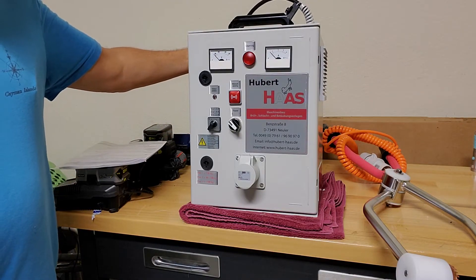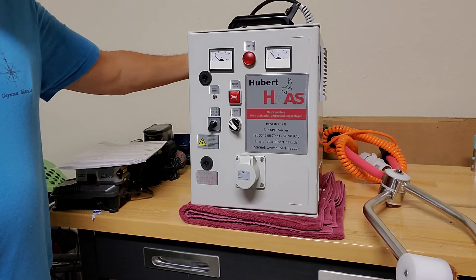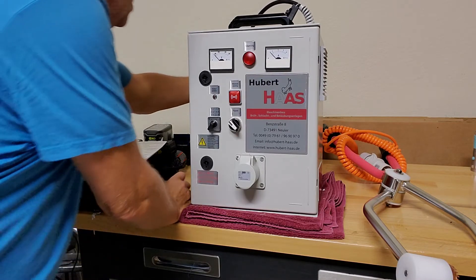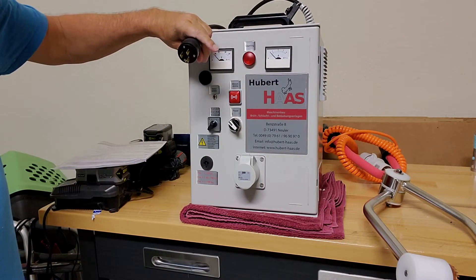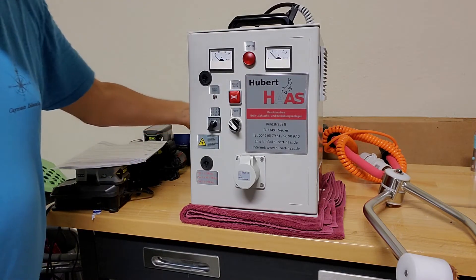The stunner will come with the plug already on it — it's a three-prong plug. I'll pull it out so you can see that it's a three-prong plug. It'll come in the box all ready to go, just like that.